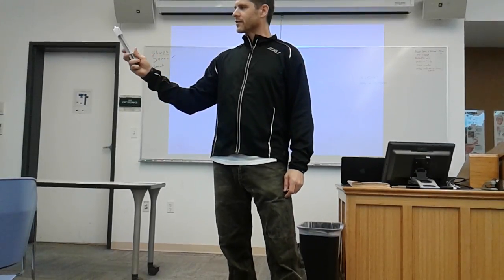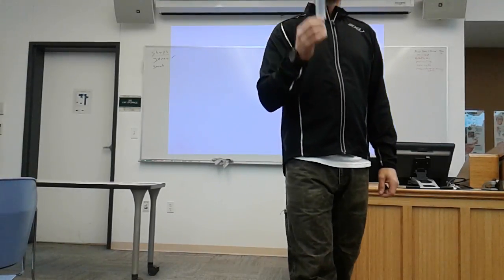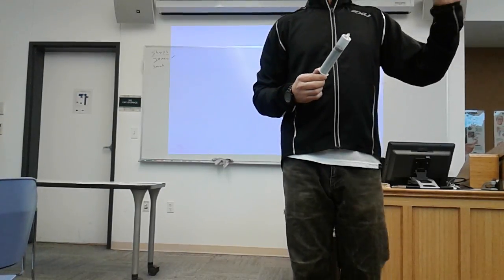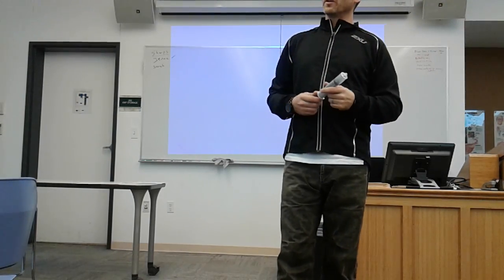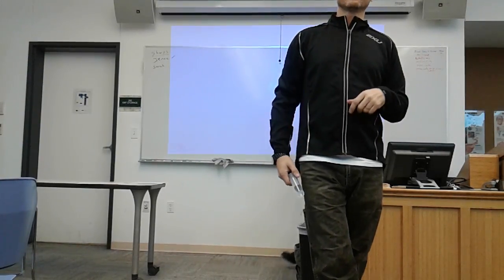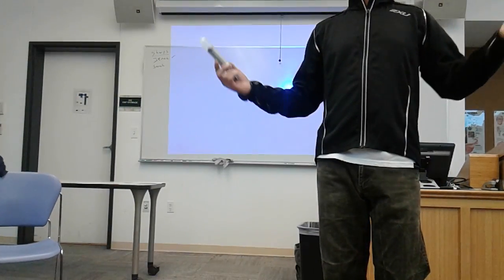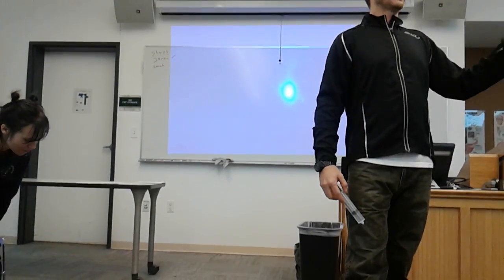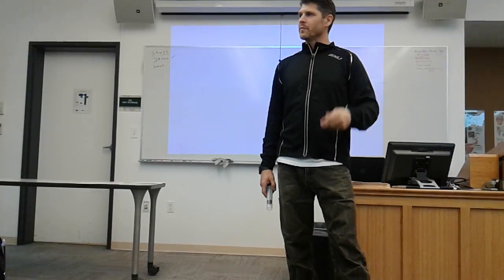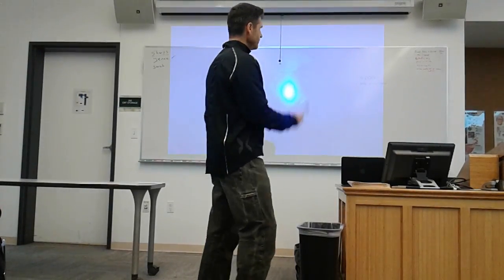If you pull faster and create a larger suction within the syringe, it will pull the blood faster. It has the potential to collapse the vein, which makes it hard. But as it's pulling that blood faster and with that much force, it'll burst the red blood cells. It's called lysing the cells, and if you lyse the cells, then the sample is worthless. And you can't tell that because it's all red. You can't tell it until after it's sent off and centrifuged down, and then all the plasma is pink. So you have to pull slowly on those when you're using that syringe. Does that make sense? All right, keep that in mind.